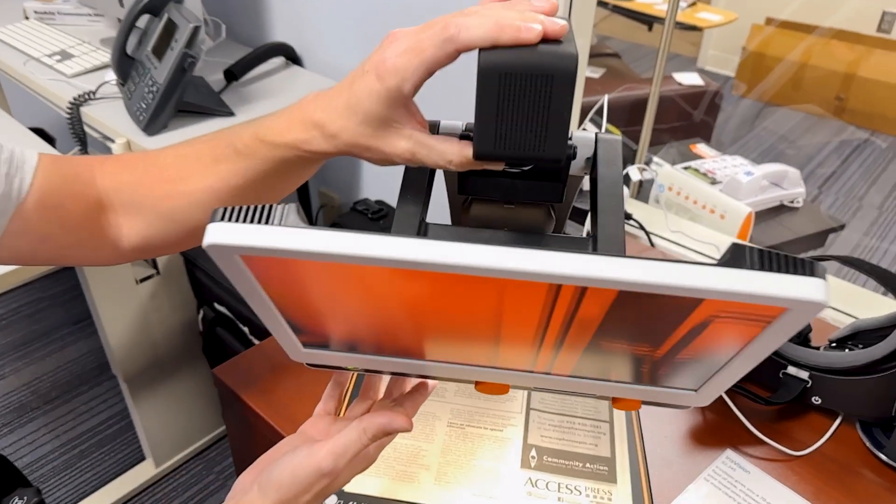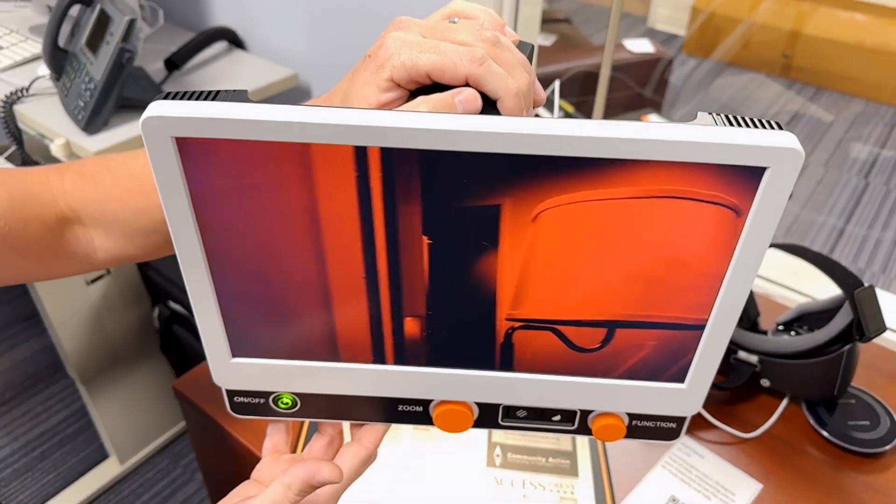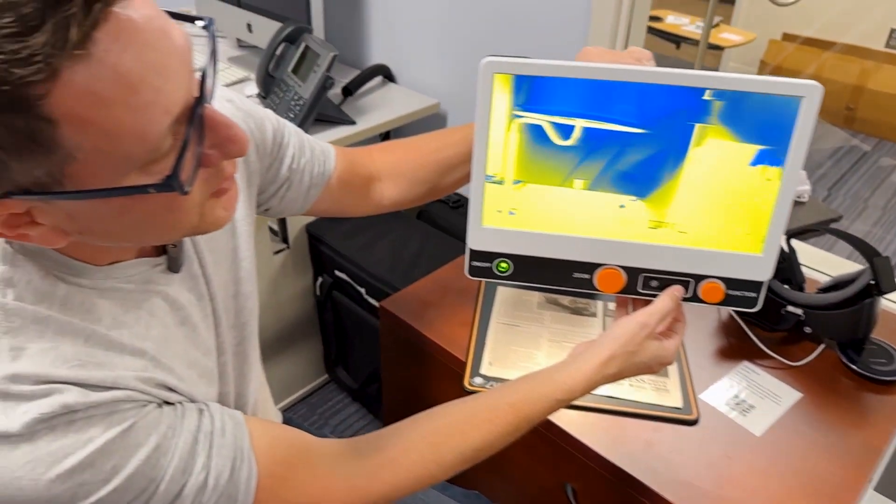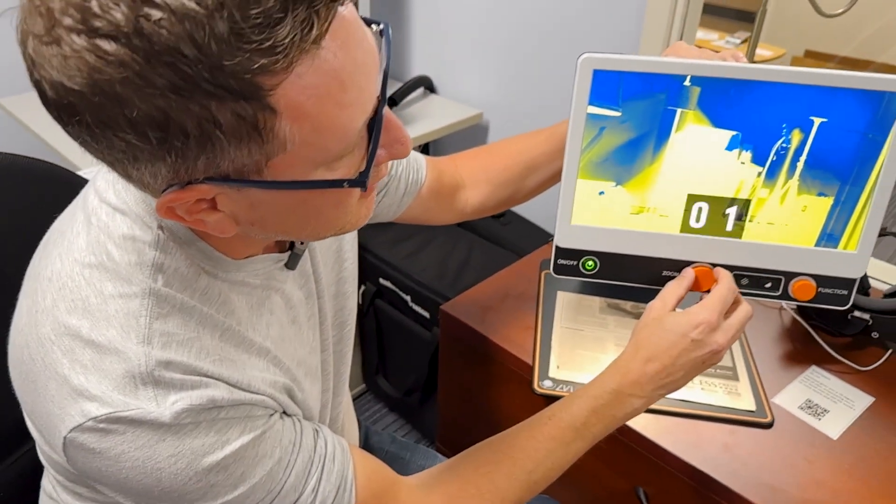On the back it has a camera that will zoom out where you can pan the room, so you can see how you can zoom in on things at a distance.